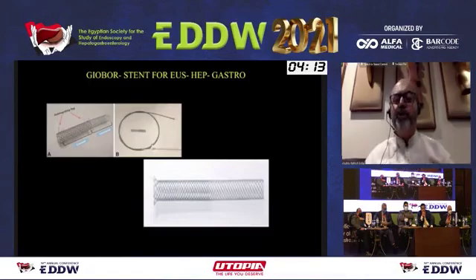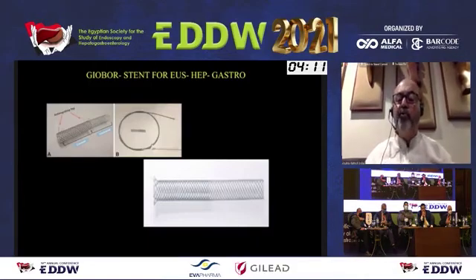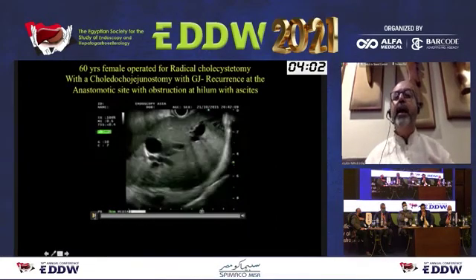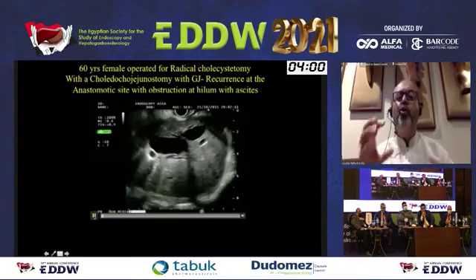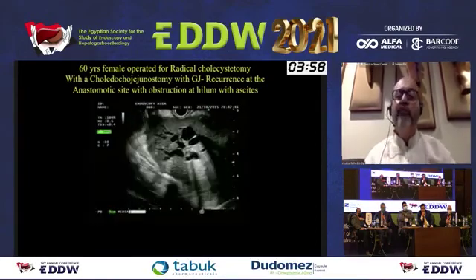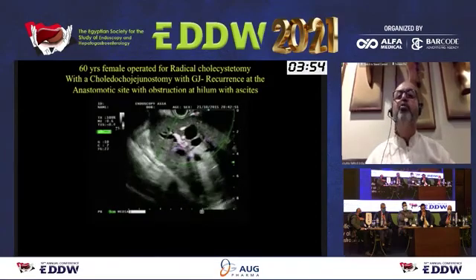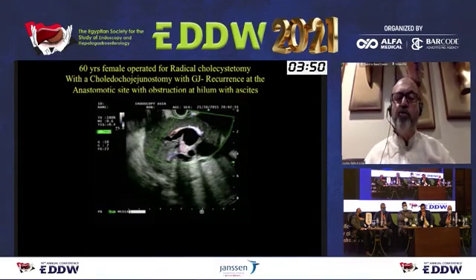Coming to the hepaticogastrostomy part. If you have complete obstruction of the duodenum or the surgical anatomy has been resected or anything, then you have no option but to go through the liver. And I personally would choose to do this procedure only if I'm pushed into a corner where there is no other option but to drain the biliary system internally this way.